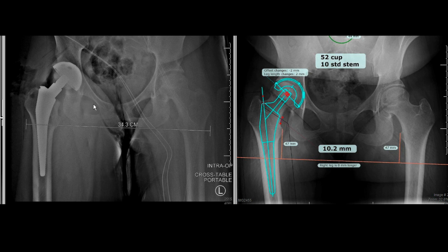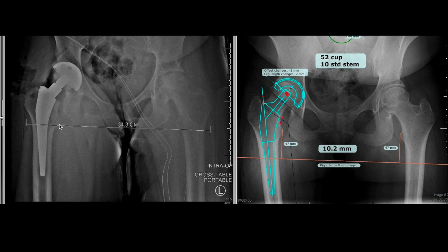The first thing we want to do intraoperatively is reproduce that AP standing radiograph from clinic. So we look at the obturator foramina on the intraop and compare this to the clinical radiograph, and we're going to reshoot the X-ray until we have this correct. We also want to ensure this is a true AP radiograph with the pubic symphysis in line with the sacrum. We're next going to look at our leg length line, using the ischial tuberosities in this case because the teardrops were not quite as clear. We can then see where the line hits on the lesser trochanters to determine how close we are on leg length, and look at the gap medial to lateral to determine our offset. We also want to look at our cup position, abduction angle, and appreciate the version of the cup as well.